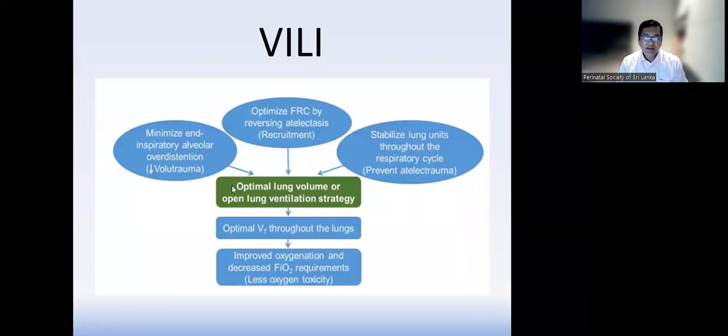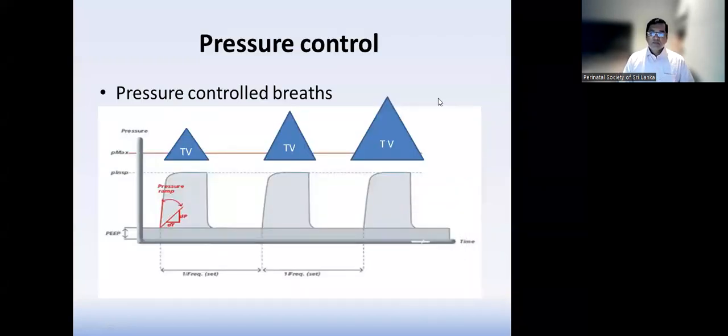So all these efforts are to minimize lung injury as a result of volume trauma. Right. So now we are talking about volume ventilation and pressure control ventilation.